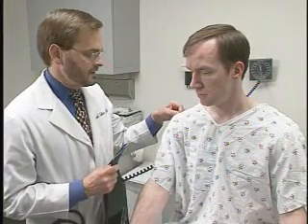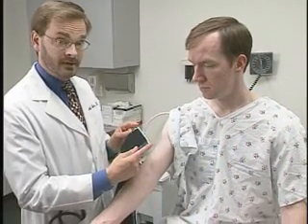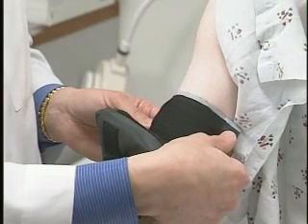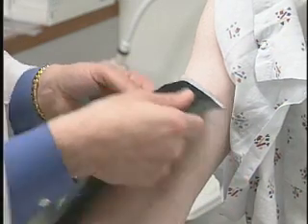To determine which cuff is appropriate, we need to measure 2 different variables on the arm. We measure the width of the blood pressure cuff against the patient's arm. The width of the blood pressure cuff should be approximately 40% of the circumference of the arm.